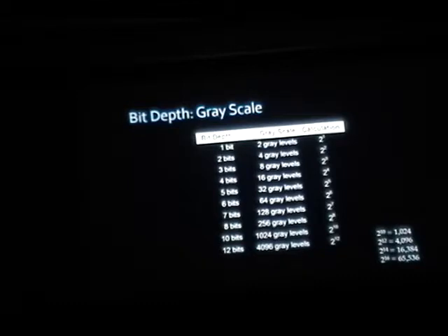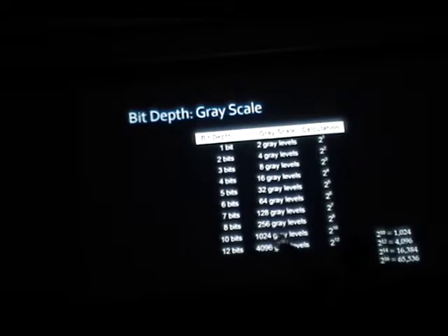An important thing that you should memorize, sorry, you don't have a choice. You have to memorize this slide. So if I say 1 bit, you are using 2 to the power of 1, so that means there are 2 colors. The most common one, the computers that you guys are using, have 2 to the power of 8, so that means you have 256 grayscales. This is your board portion.